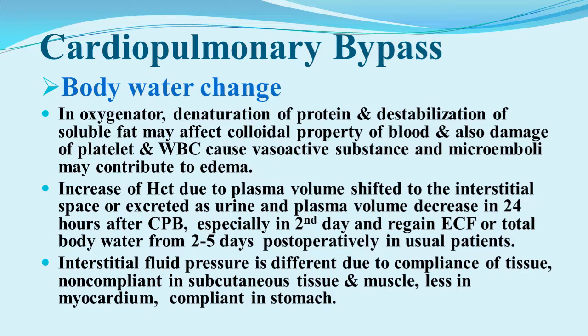Body water change in the oxygenator: the denaturation of the protein and destabilization of the soluble fat may affect the colloidal property of the blood, and also damage of platelets and WBC may release vasoactive substances, and microemboli may contribute to edema. Hematocrit increases due to plasma volume shifted into the interstitial space or excreted as urine.